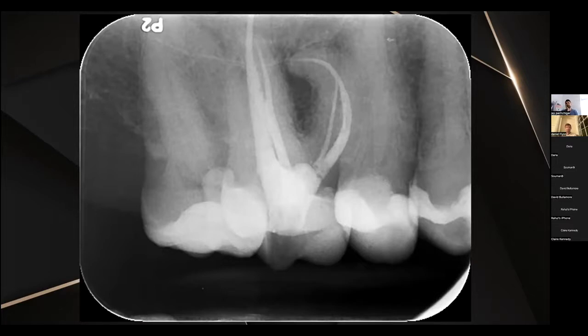Yes, for sure. For a tooth like this, I would traditionally go in a bit higher. But I put a ton of effort into that MB1, and this was actually a dentist that I was treating. As soon as I found that the MB2 joined, I really didn't go that high. I think this was just a 17/04 actually. So there was no real need to go any higher.